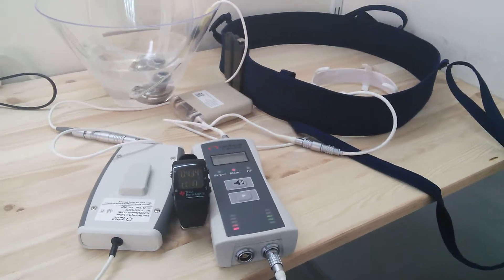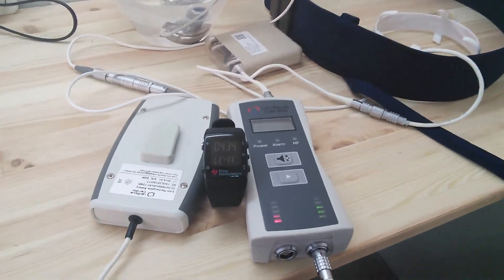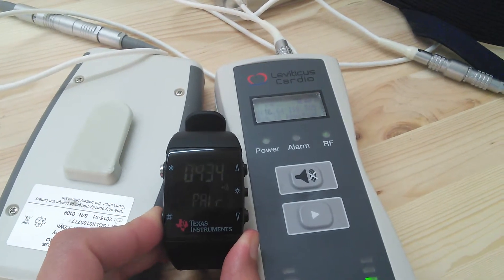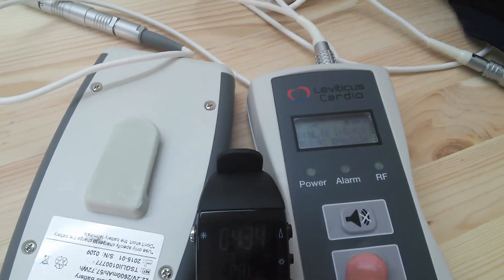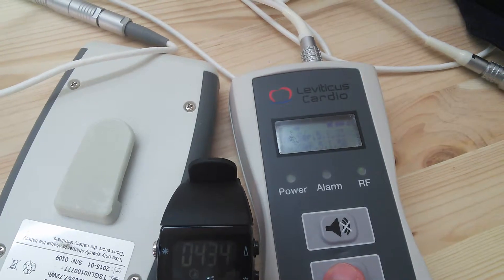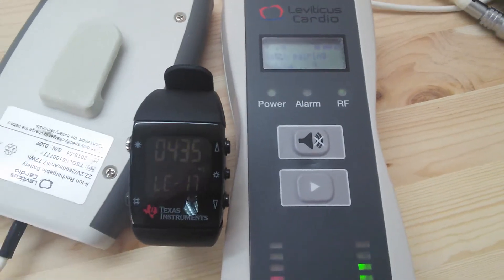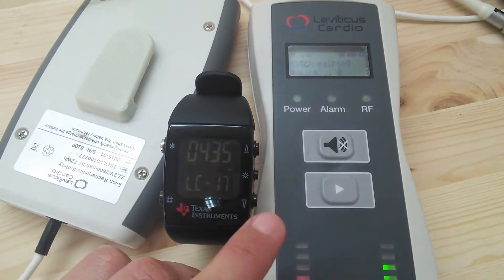Now we will connect the user watch to the implant using the external. We will press this button on the watch, and it shows pairing. We will move in the external to the pairing screen. Starting watch pairing — and it is connected to number 17.